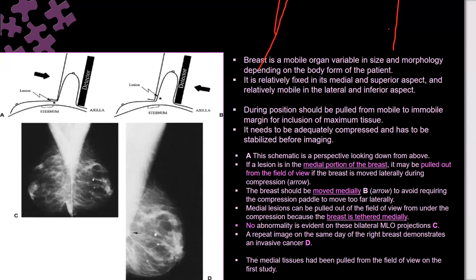That is why I explained, Suhair, that they probably have seen it. It concerned them clinically, or they have seen it on ultrasound, or it might have appeared on the CC view. Otherwise, I will not repeat the MLO unless there is a background, a reason, on the medial breast.